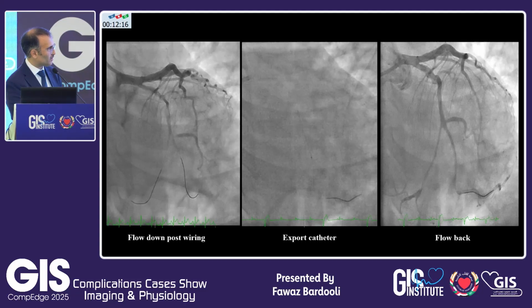The proximal segment has improved a little bit, and it's better in the AV circumflex vessel, but I still do not know how much I need to treat. Do I need to treat from down all the way with 2 stents, or should I stick only to the proximal, and this is only a spasm and a clot? So I'm not really sure about it. So what I've done is I took the OCT catheter down.